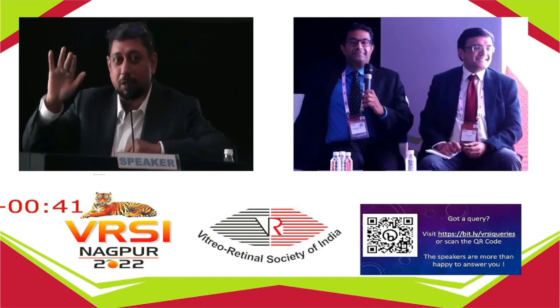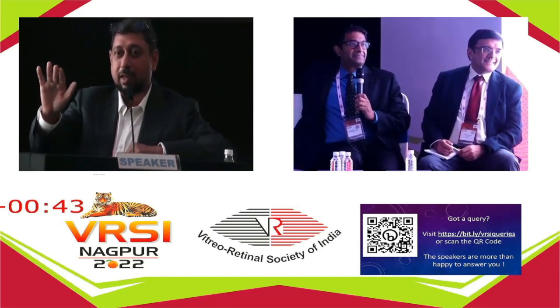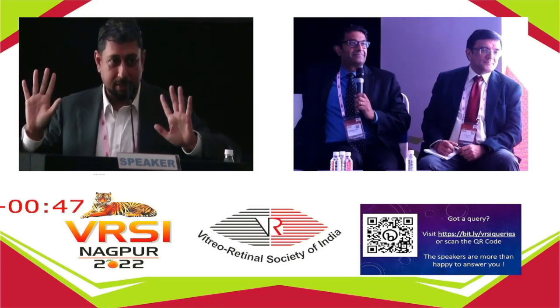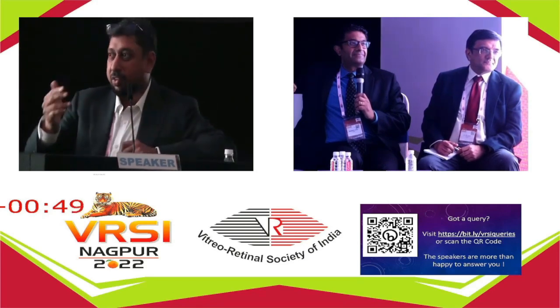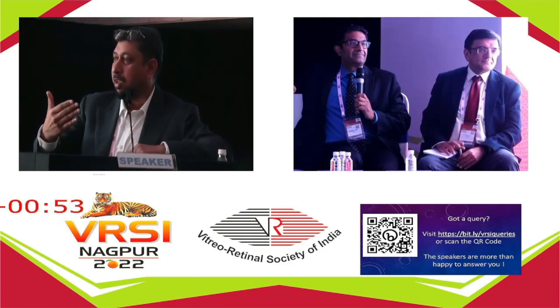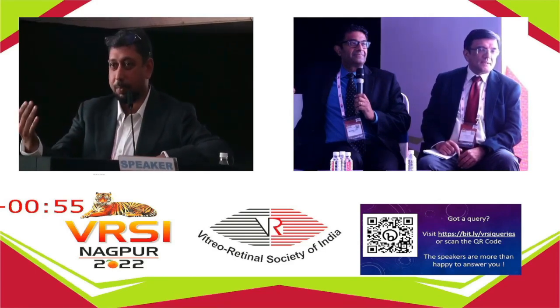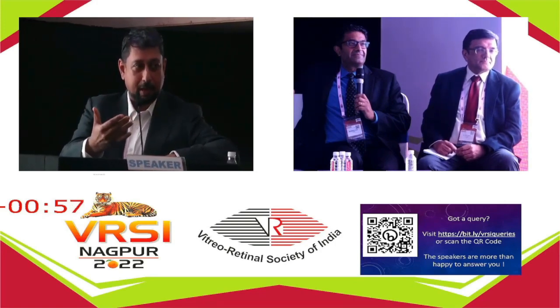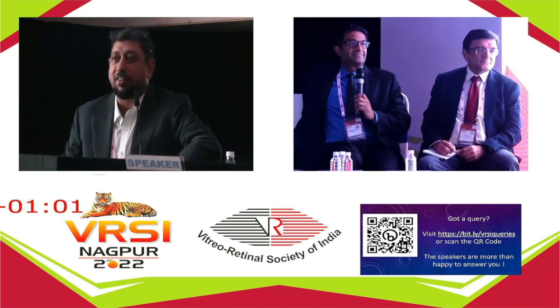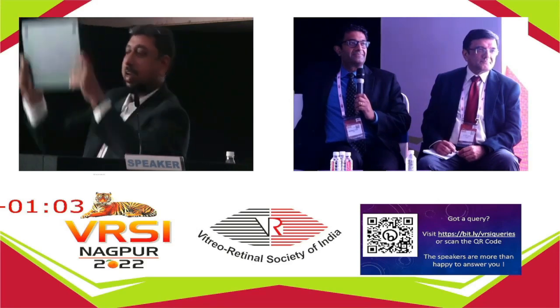When most people got the OCT, it was look at the color map, see if there was CMT, and I don't have to know anything else. Then after some time, people actually started looking at the B scan and seeing that this was a pattern, this was another pattern. If I realize this pattern, I would treat my patient better. But still, we have people who say, lift the color code, and I will inject or not.